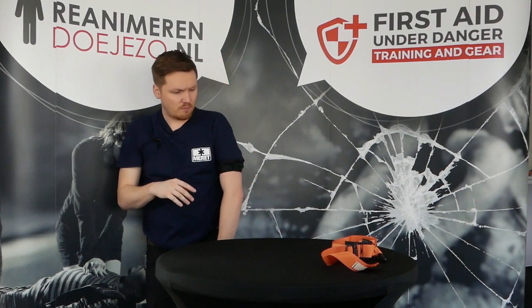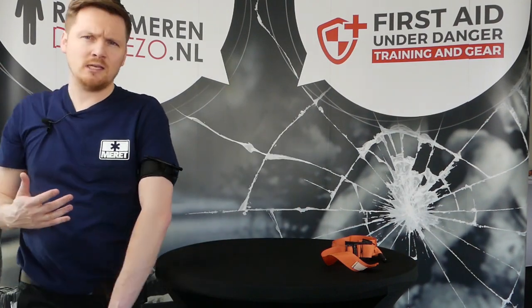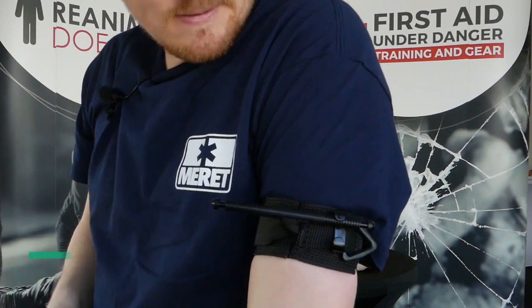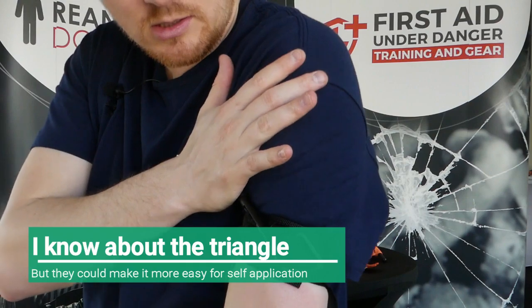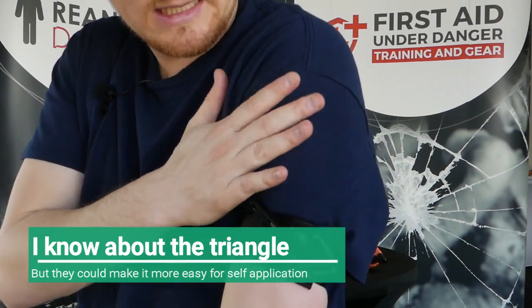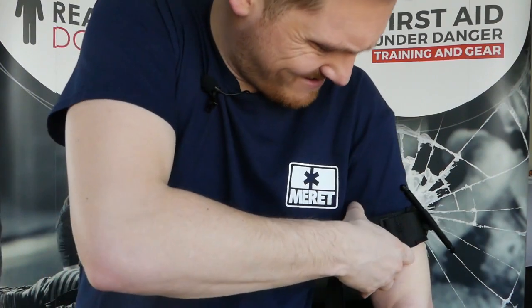I do believe that this is a major advantage to what it was, but still you have the possibility that it might get undone, especially in the hospital setting. This could get undone much more easily because there is no strap. For example, if you push it, or if you get stuck somewhere, it can pop out quite easily. So that is something that I do believe they still need to take a look at. But yeah, I do think there's a major advantage to what it was.